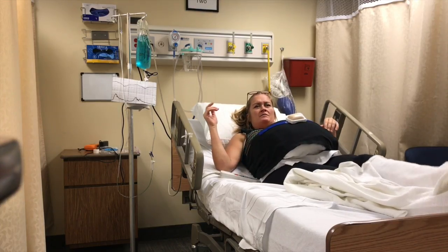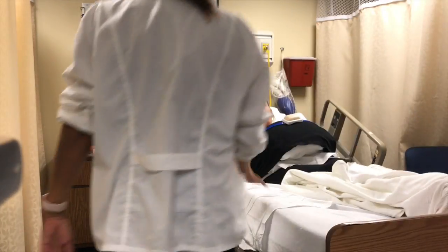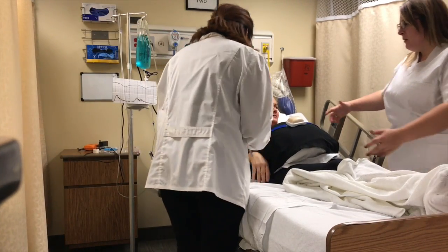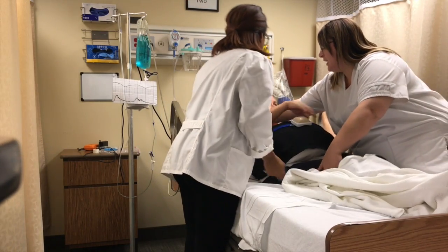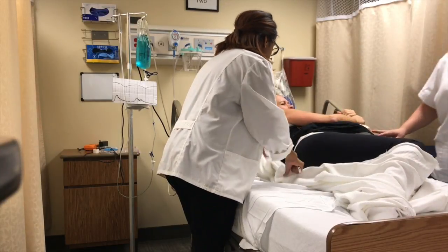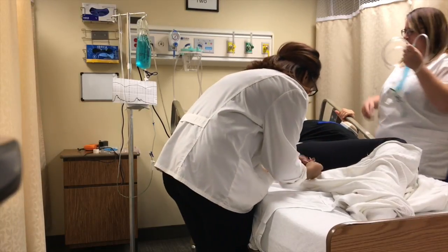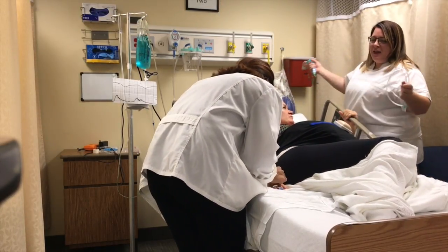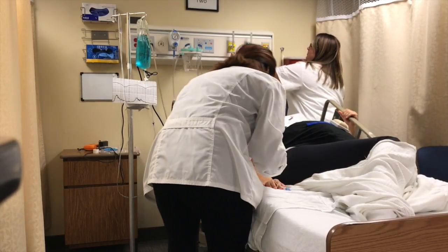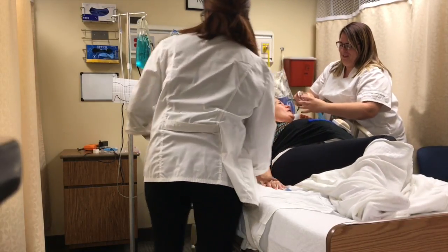What's going on? Beep, beep, beep. Oh my gosh, something's wrong. Nurse, doctor. Hi, Missy. Looks like you're going into late deceleration here. We better lay you on your side. What's happening? We need to administer oxygen to you. Is that for me or the baby? You and the baby. Doctor, can you put an IV in? It looks like your baby's losing oxygen every time you contract, so we gotta take care of that. Here comes another contraction. Yep, so we got you on that IV.